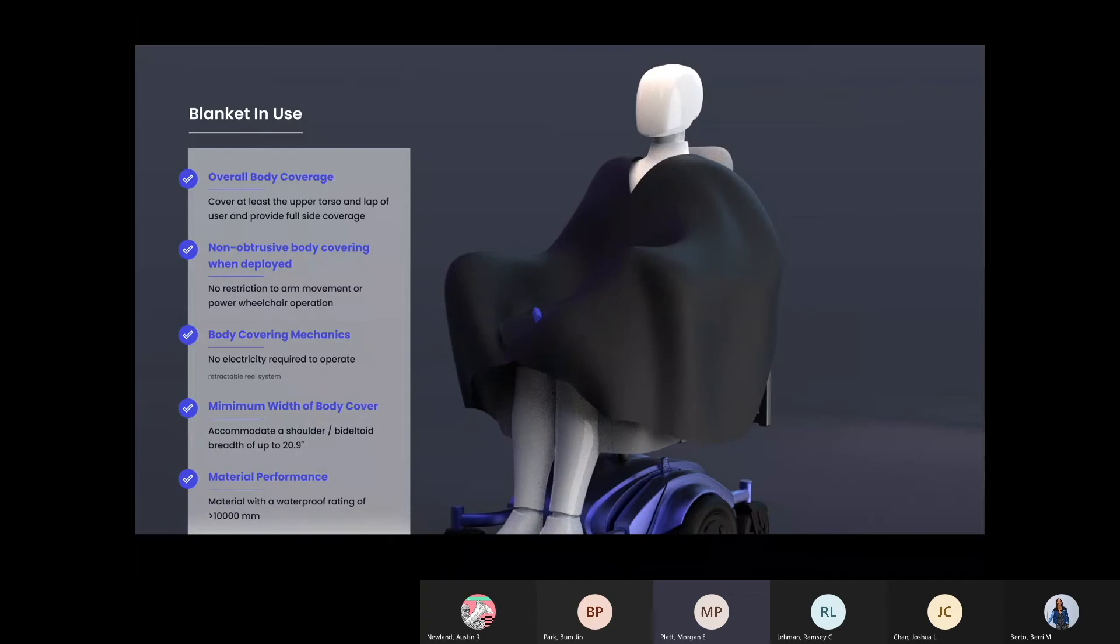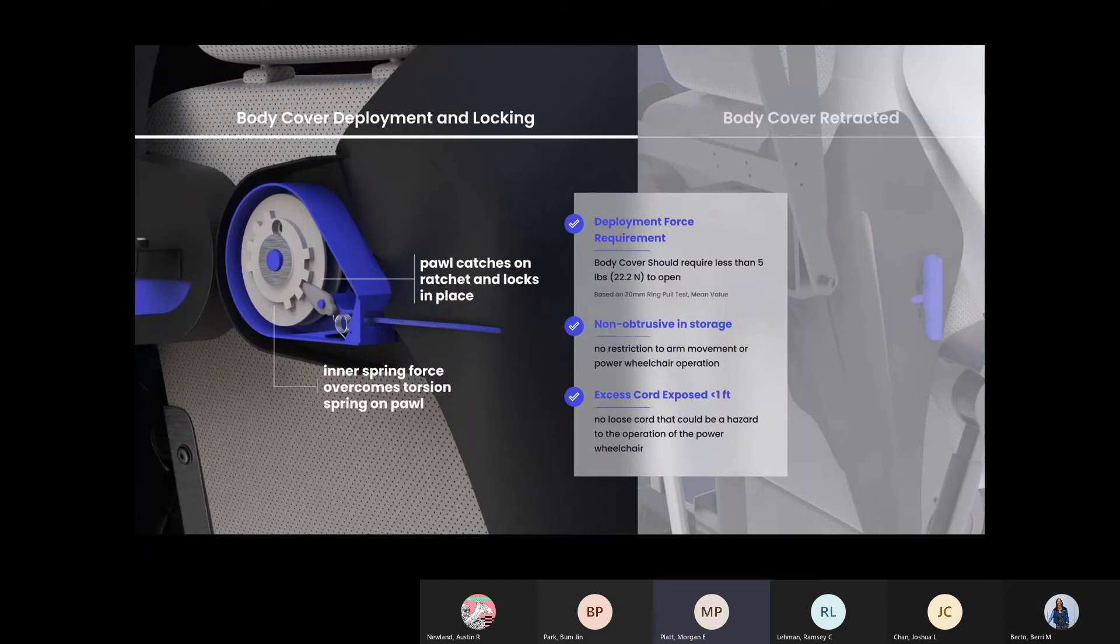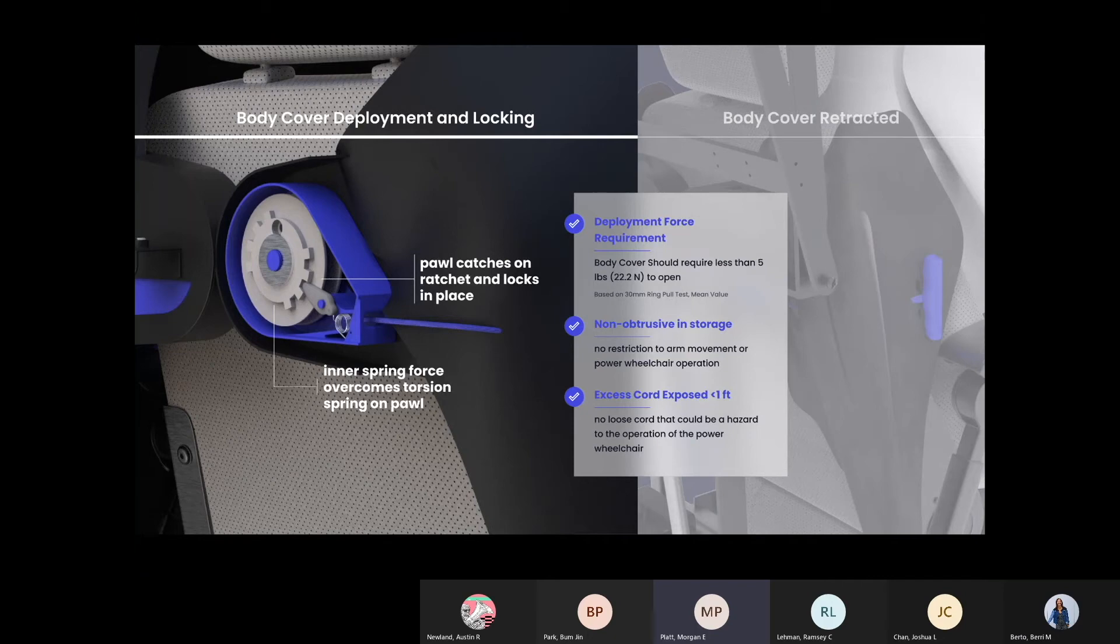Key overall considerations included overall body coverage, requiring no electricity, and material performance of the shroud material. This view shows the inner workings of the ratchet and pawl system used to pull the fabric cover out. The idea is that you would pull the handle connected to the fabric and it would lock in place once fully extended.